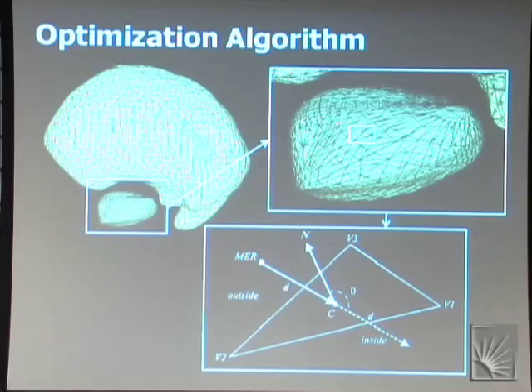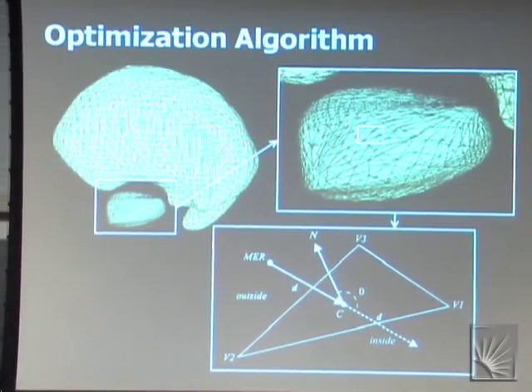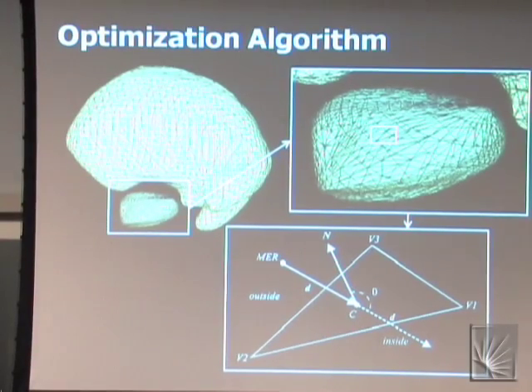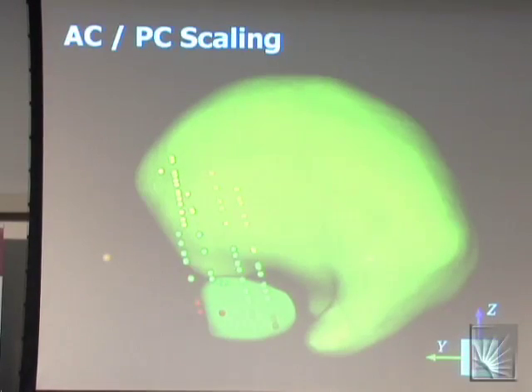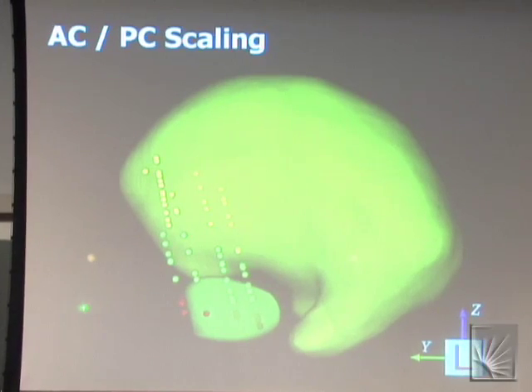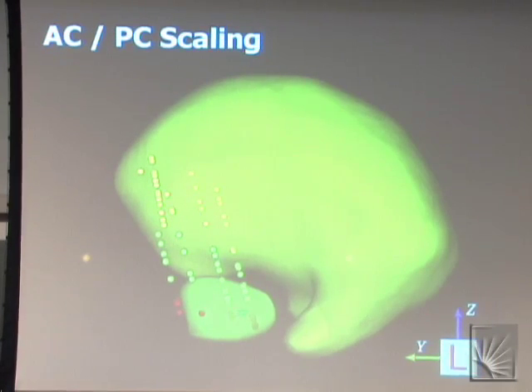And using some trigonometry, you can start to calculate whether these little recording points are inside of this nucleus or outside of that nucleus, or if some of these that aren't supposed to be in this nucleus are in there and you want them to be out.